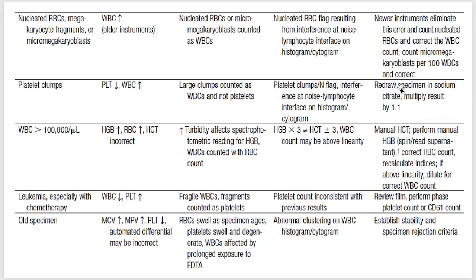Anong tubes ito? Red, black, green, or your blue tube. And you just multiply the result by 1.1. Pero kung ako hindi na lang ako mag-redraw. I'll just do manual counting. Mas madali yun.